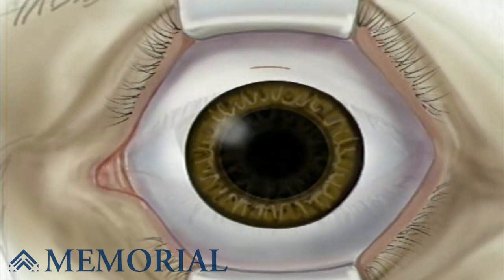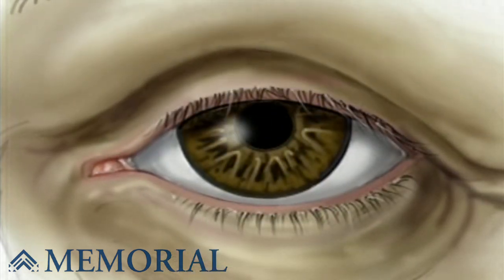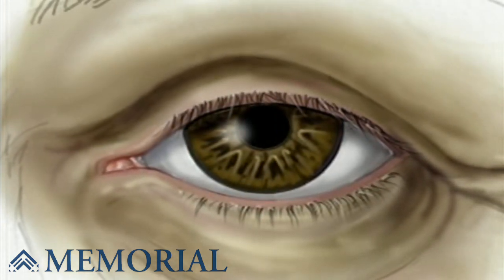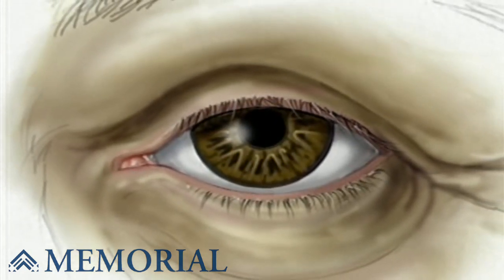With the tip of the injector inside the eye, the surgeon slowly injects the new lens, where it unfolds into position. Because of the small size of the incision, often your surgeon will complete surgery without putting in any stitches. Vision will gradually improve during normal healing over a period of five to eight weeks.